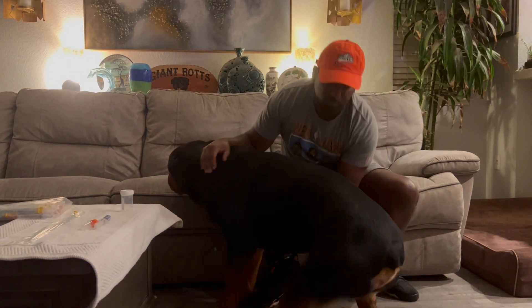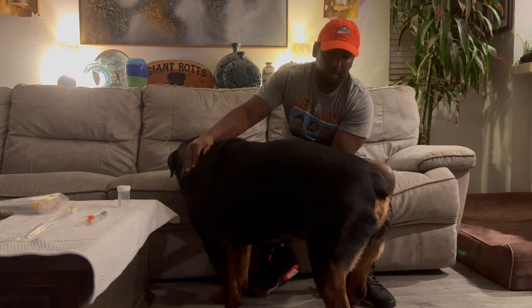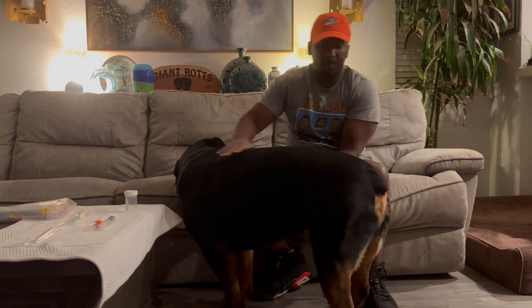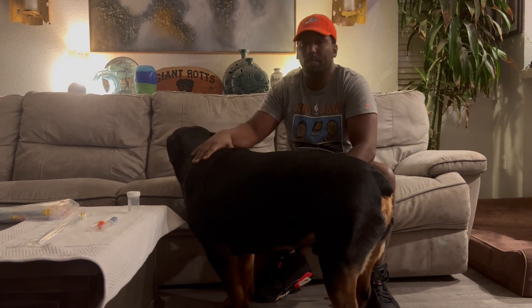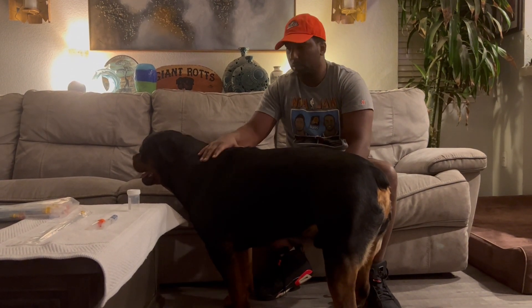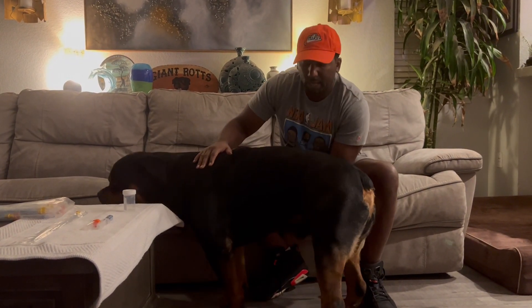Up, Samson. Up. First tip right there — that's how you get your dog up. So we bring Samson and Delilah today. Delilah's one of the biggest, beautiful female Rottweilers in the game.